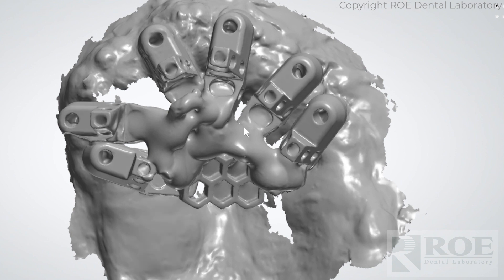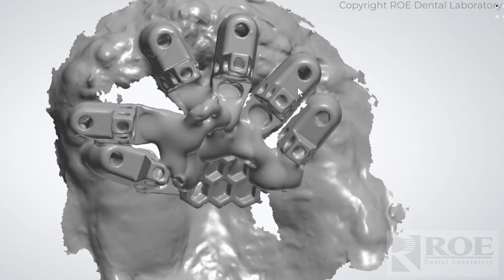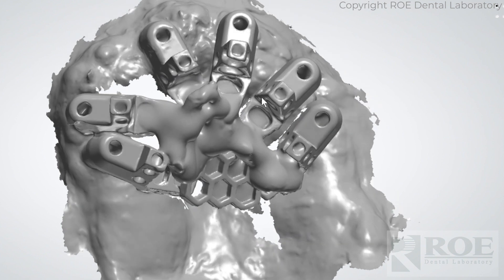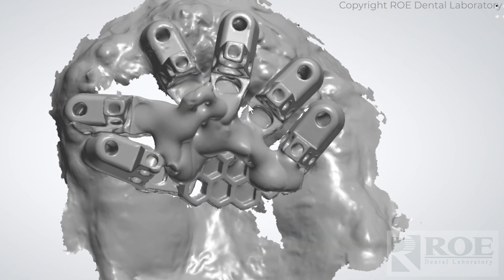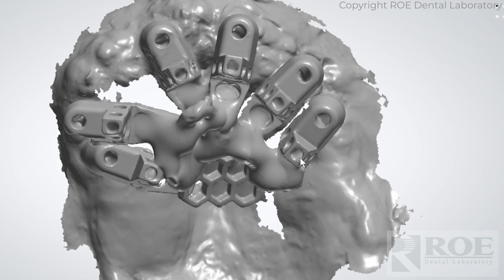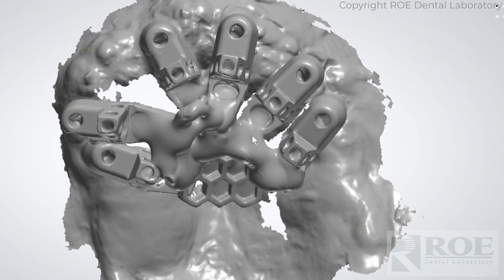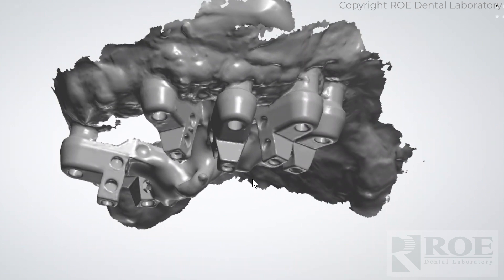The doctor continued on with the surgery and finished the rest of these two implants, attached OptiSplints to the rest of the implants, luted them together, and then scanned in the mouth. This could have been scanned intra-orally or extra-orally, but it's a good idea in this case to scan it in the mouth first to pick up the tissue again and make sure everything is aligning nicely.